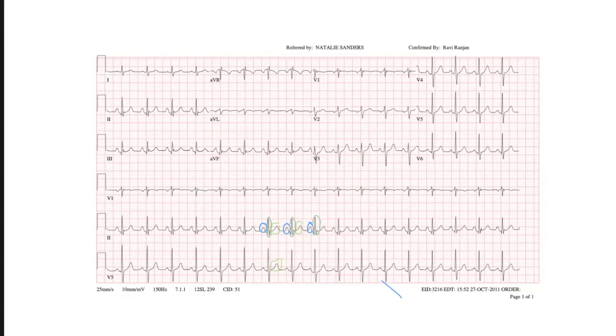Okay, so Derek, do you think we have a regular rhythm or an irregular rhythm? Let's see. It looks pretty regular as well. So then, Tanner, what do you think we call the disease state of this based on the rate and rhythm we've decided? Tachycardia? Yeah. Is it sinus tachycardia also? Exactly. Is there a different kind of tachycardia? We'll get there.